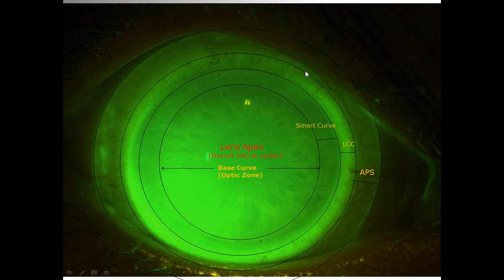Sure. I think that when the lids are in their natural position, it's going to be common to see that thinning of the fluorescein superiorly, just as a factor of the upper lid pushing the lens in an inferior position. There's been plenty talked about at meetings and lectures on scleral lenses, that if you've got 1 or 2 clock hours where that fluorescein is thinned out, that can be acceptable. The thing I like to do is pull the lids back out of the way and get the lid tensions off the contact lens and then really reassess that fluorescein again. If I still have decentration, which looks like it's creating a superior thinning of the fluorescein, we want to assess again, do we need to go with a toric APS, because typically a toric APS will give us a better centered lens.